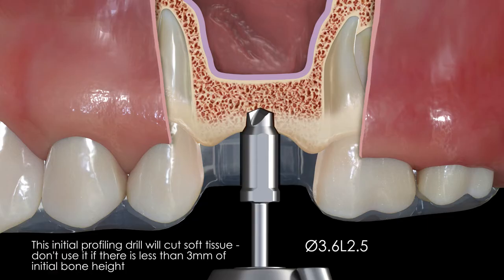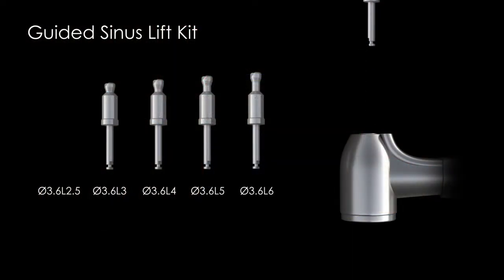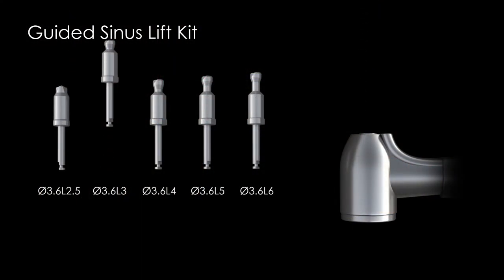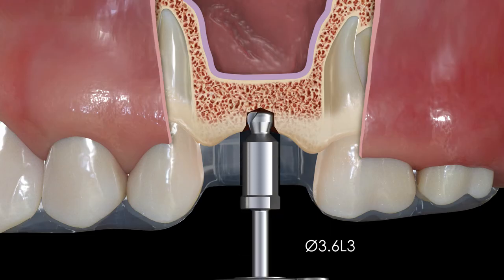Seat the surgical guide and start the osteotomy with the 2.5 millimeter long profile drill running at 800 to 1200 RPMs. Drill until the built-in stopper bottoms out completely on the guide. Continue to the next 3.6 millimeter wide by 3 millimeter long safe-ended drill.